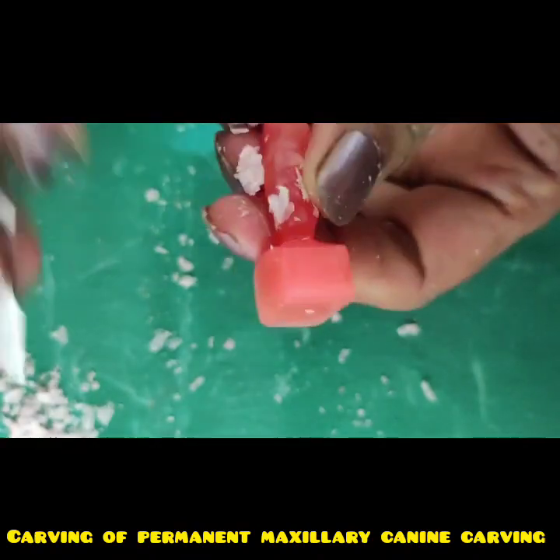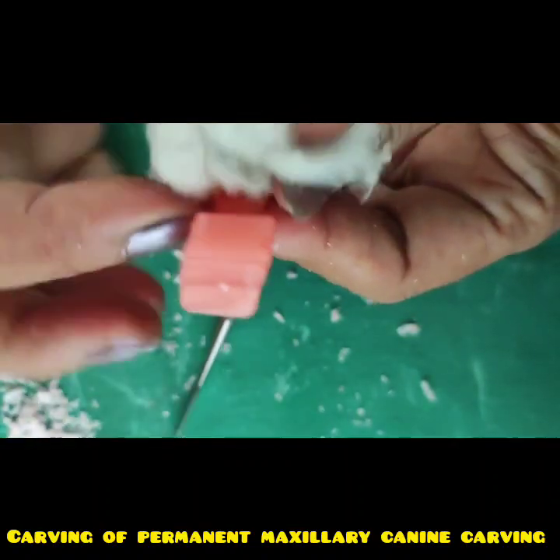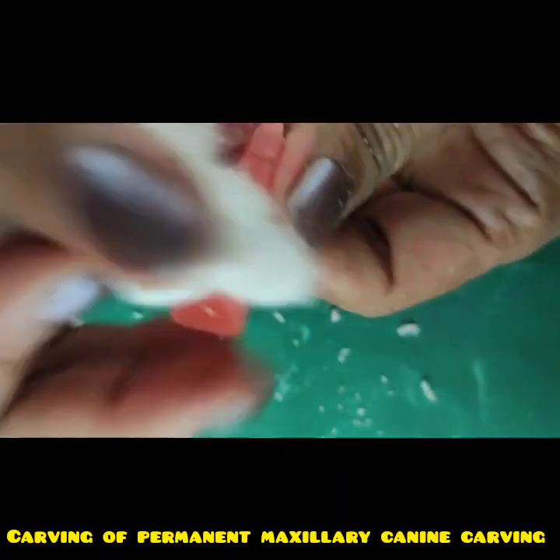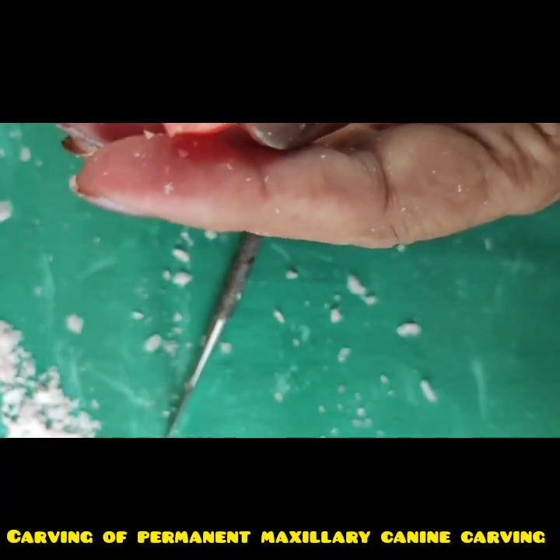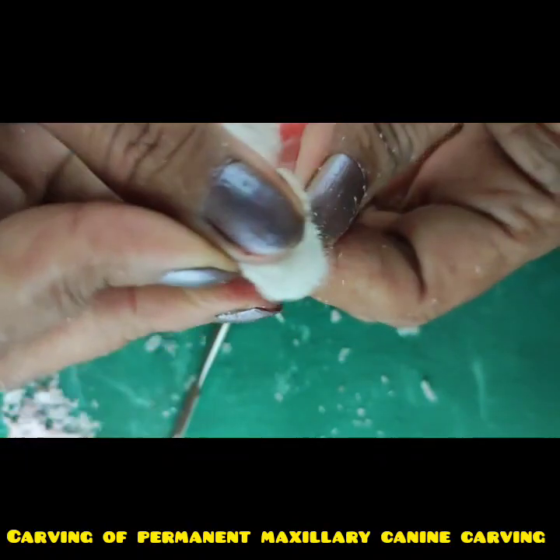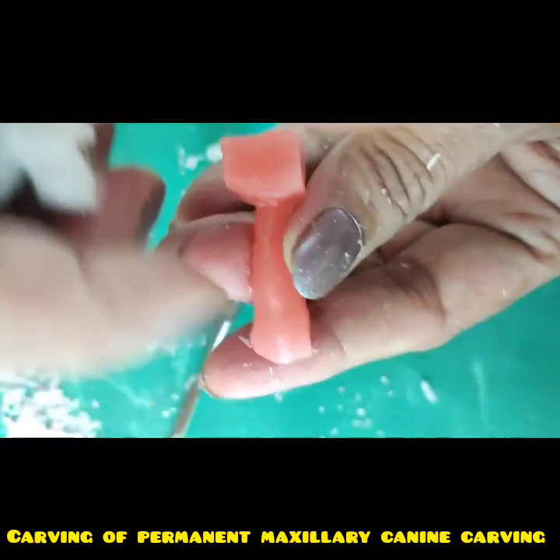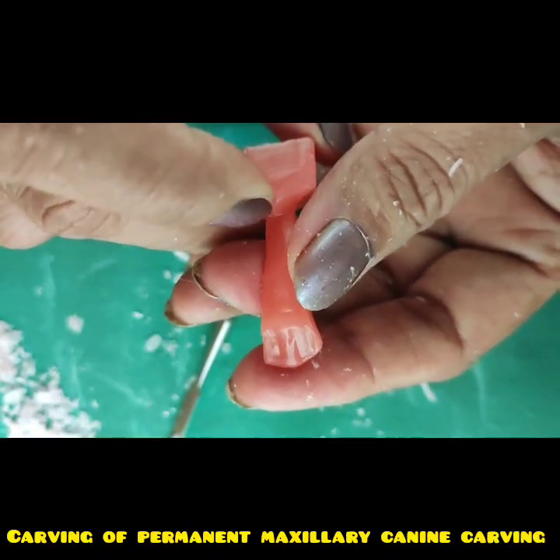Define the details on the crown and polish it properly. So this is how our crown is done with the two triangular fossa.